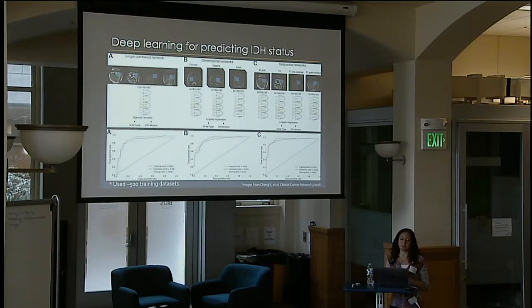And we need to incorporate other imaging. We have an array of physiological imaging, at least, that is routinely done clinically now, and how is the best way to incorporate this, and what is the best network.